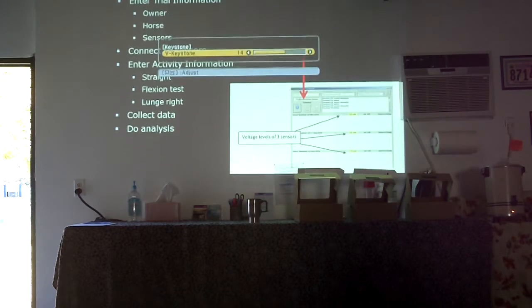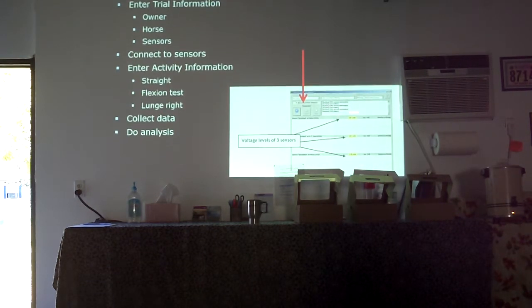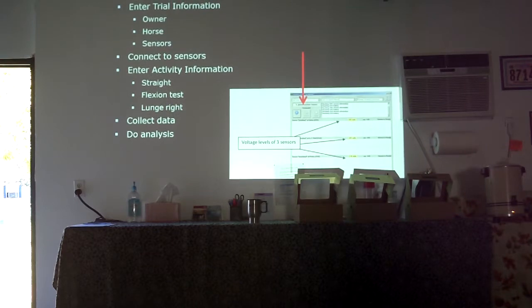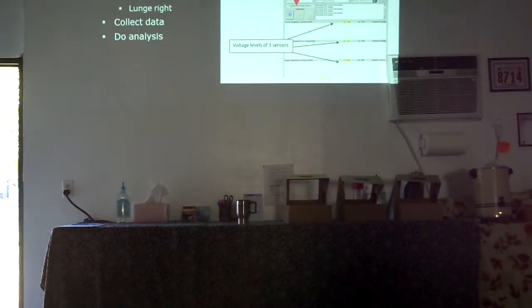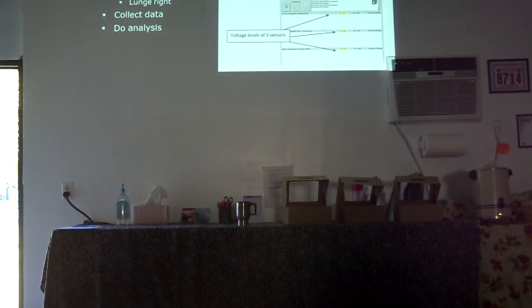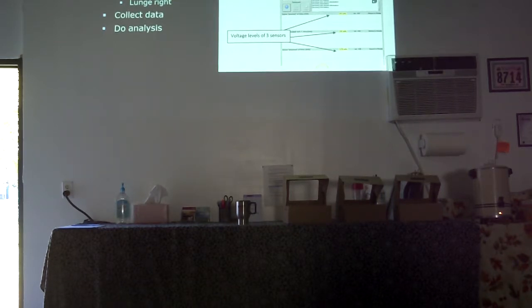Once you get everything entered into there in the sensor group, there's a button right here that says Connect the Sensors. You click it, and it takes a few seconds, but you'll start to see some information up here. Once the battery voltage on the sensors is shown to you, it's color coded: green is fully charged, yellow is starting to get a little bit low, red is, you better charge them up. Usually you've got maybe about 15 to 20 minutes if it's in the red. The sensors will last all afternoon. I don't think you'll get into the red. Once you see the battery voltage shown here, then it's ready, and then you hit Start.